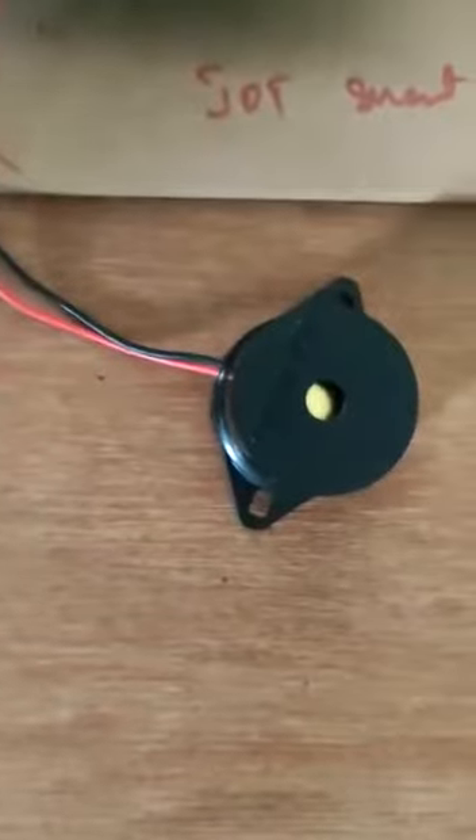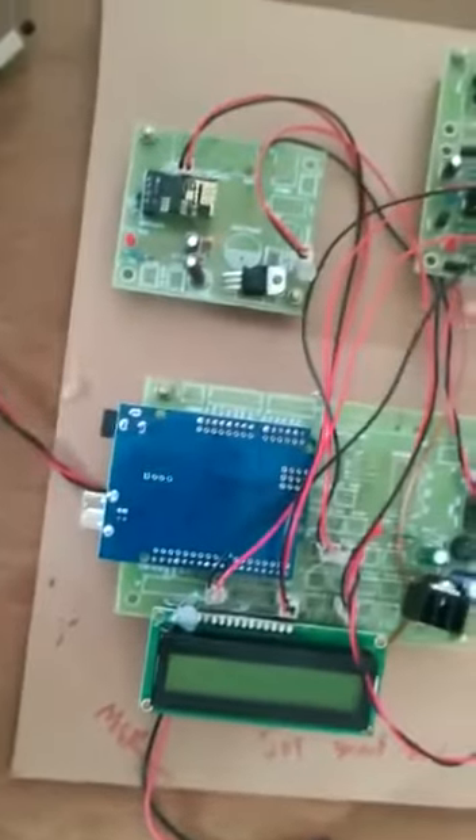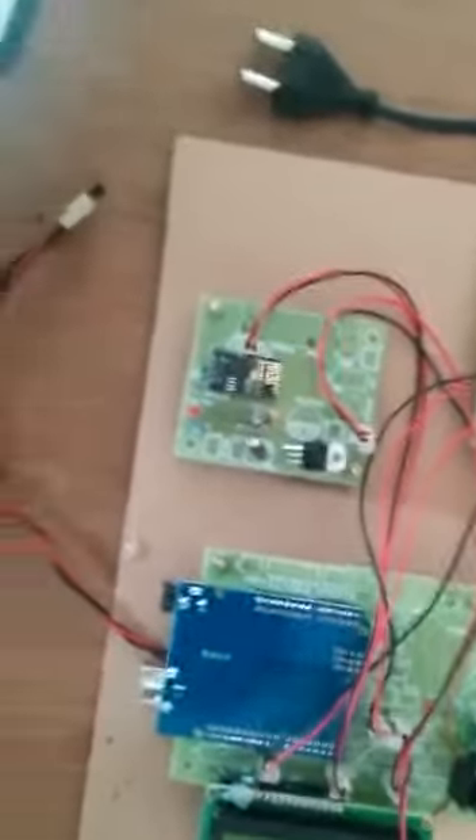This is the buzzer. It helps to notify the doctors about the saline level through a beep sound. Here we are also using a TCP Telnet app, which displays the results. This is the kit of the project and these are the values. Thank you.